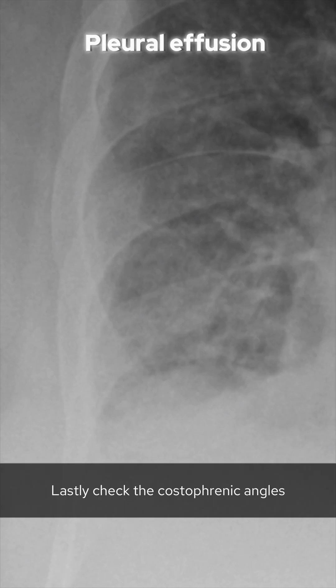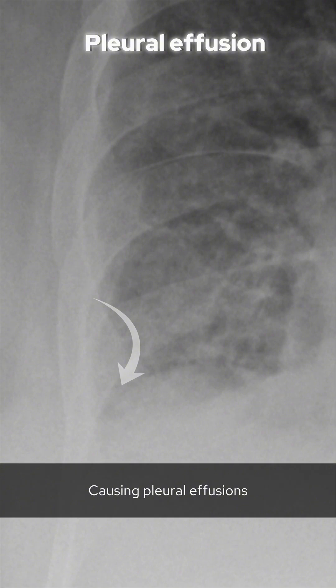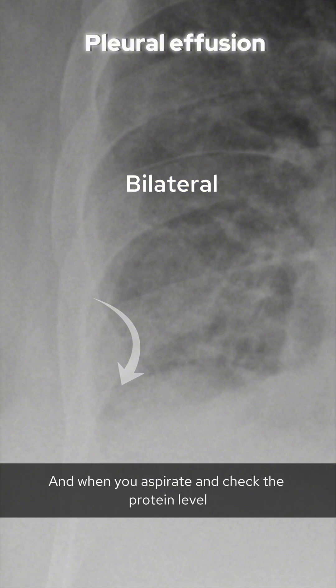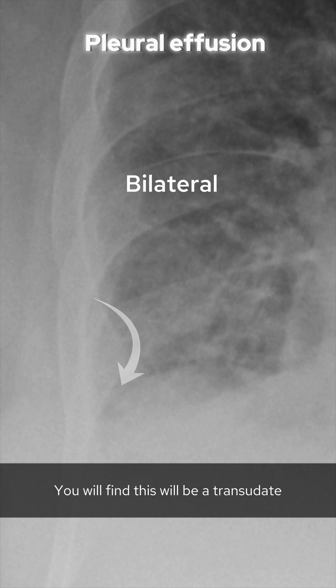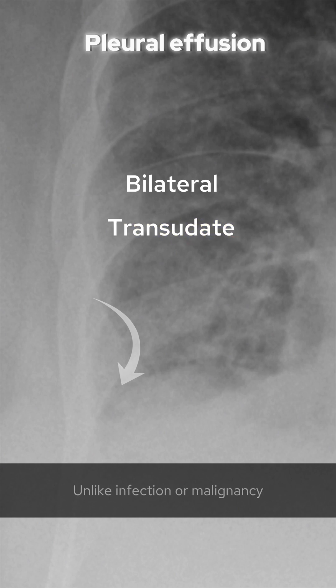Lastly, check the costophrenic angles, as fluid leaks into the pleural spaces causing pleural effusions. This is usually bilateral, and when you aspirate and check the protein level, you will find this will be a transudate, unlike infection or malignancy, which will usually cause a pleural exudate.